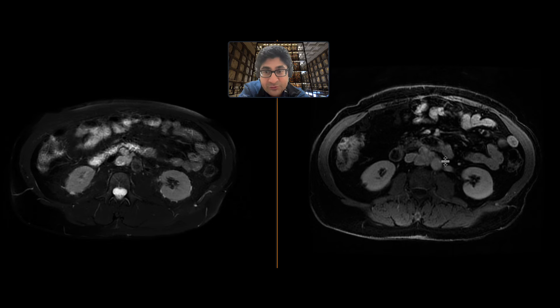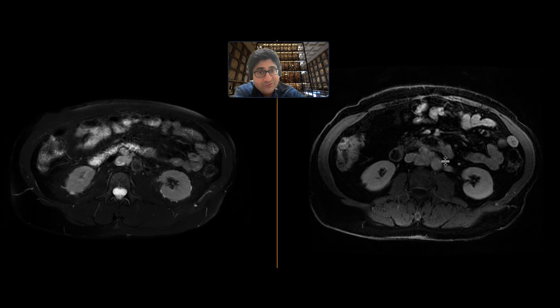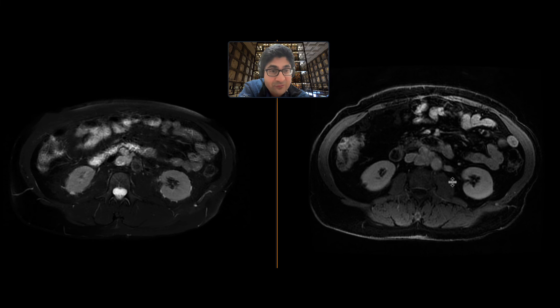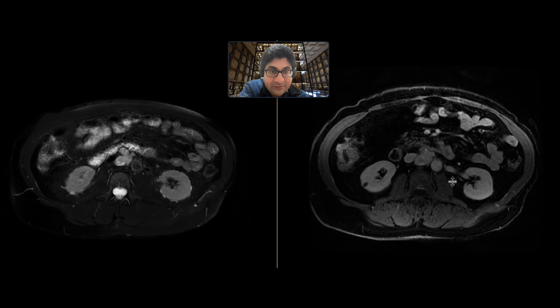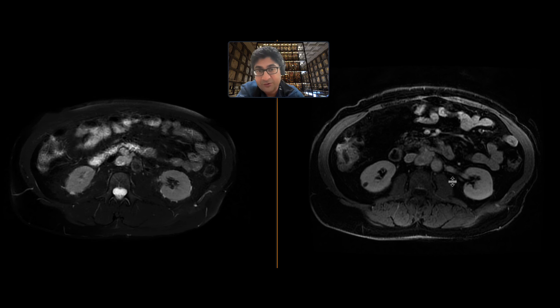When you see a hypervascular mass, it may have that classic T2 light bulb bright signal. In the context of biochemical abnormality, you really need to think about a paraganglioma. In this instance, the organ of Zuckerkandl is a very common location to see this outside of the adrenal glands.